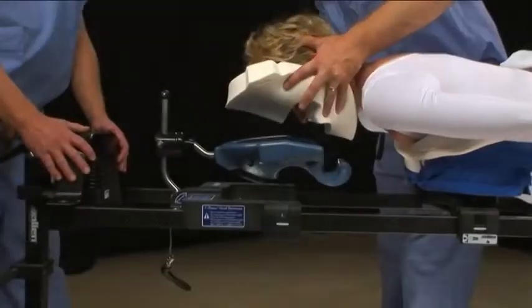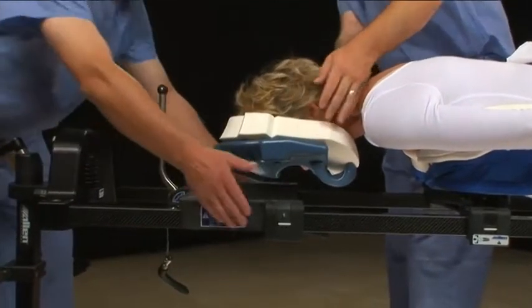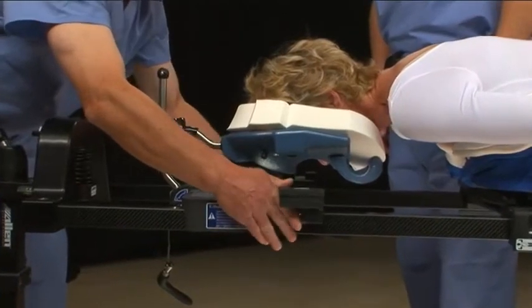Now it is time to adjust the patient's head. Rest the patient's face in the C-prone mask. Adjust the position of the C-prone so that the face is fully supported.